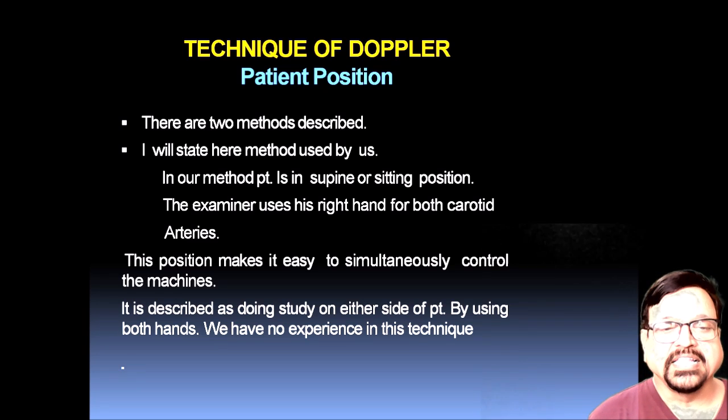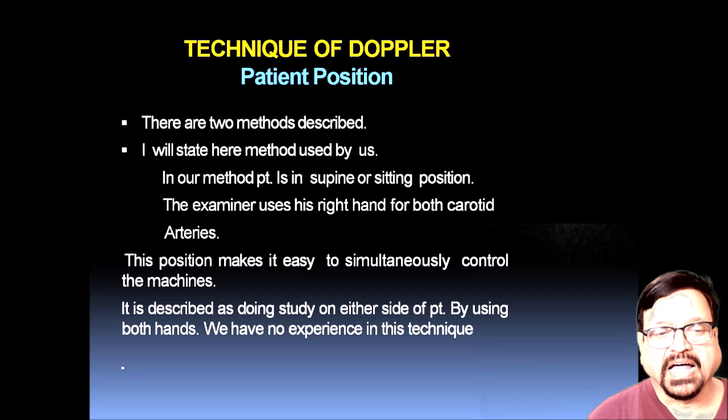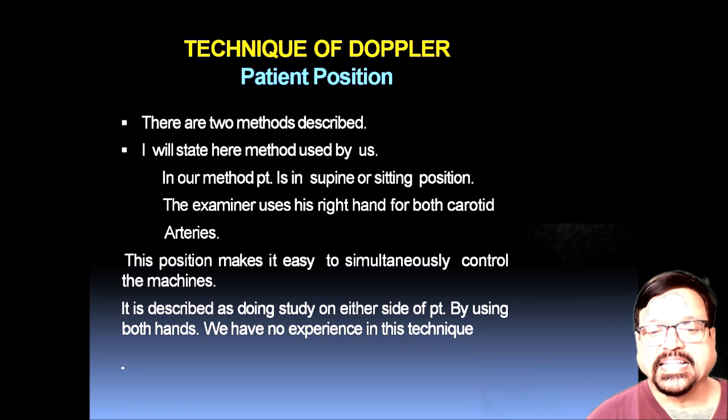Patient's position. There are two methods described. I will state here the method used by us. In our method, the patient is supine or in sitting position. The examiner uses the right hand for both carotid arteries.